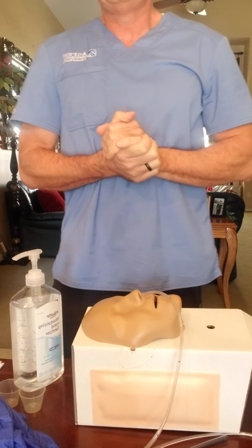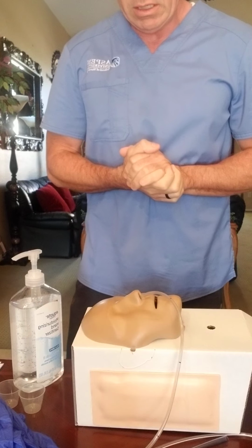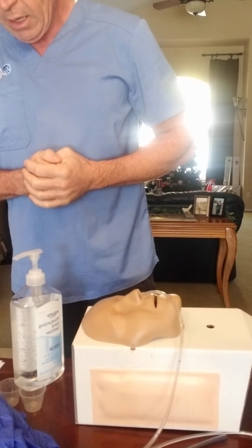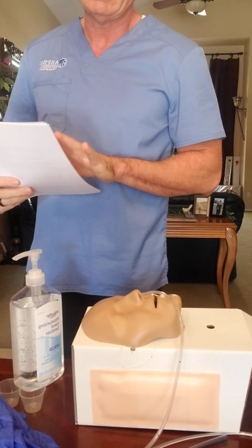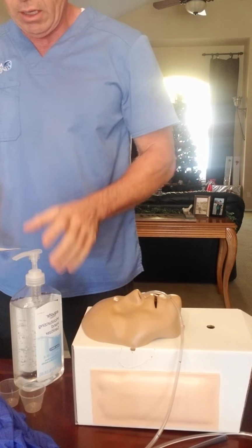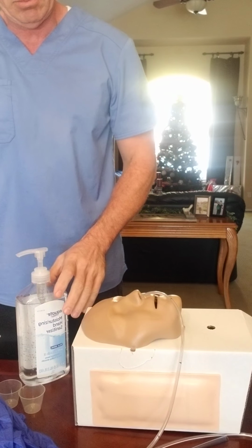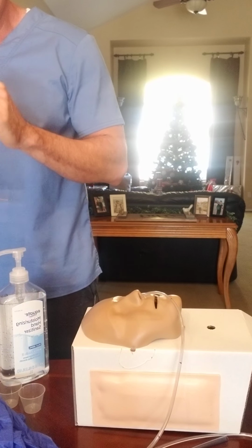Today I'll be demonstrating how to do medications via NG tube. And first off, I'm going to go check the doctor's orders, and then I'll verify these orders with the MAR, and then go gather my medications and my supplies. And the order makes sense.